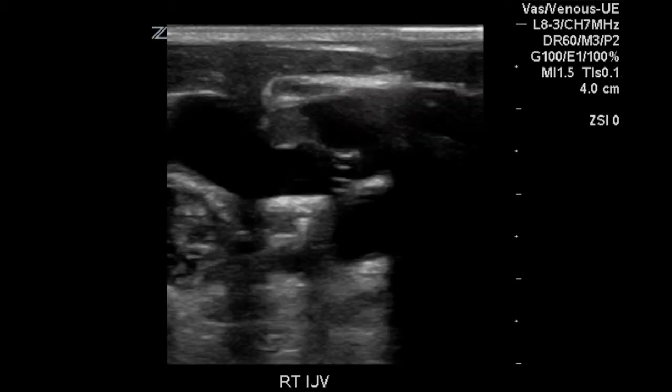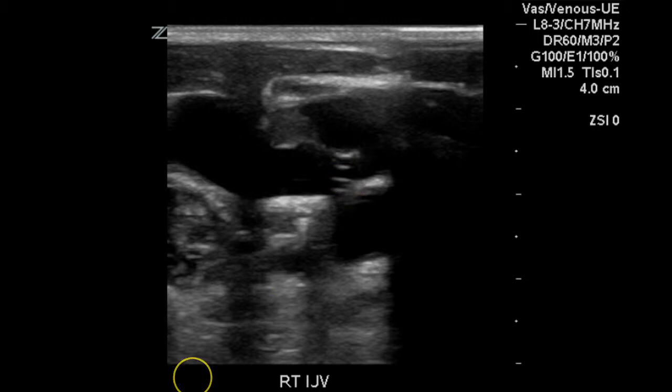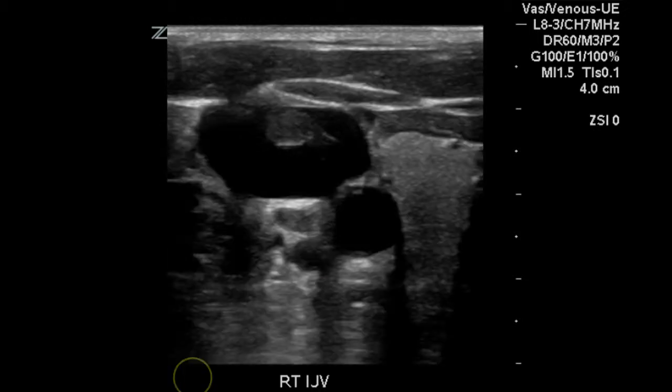Here is another image of the jugular vein demonstrating the presence of the PICC line within it. Another transverse image of the thrombus within the jugular vein on the right side.